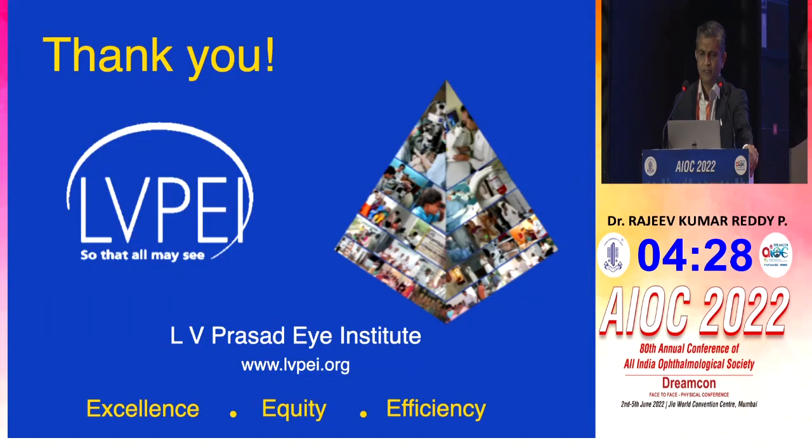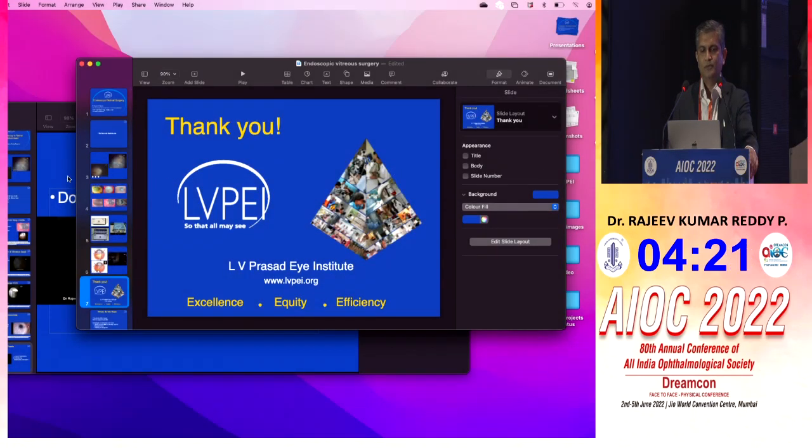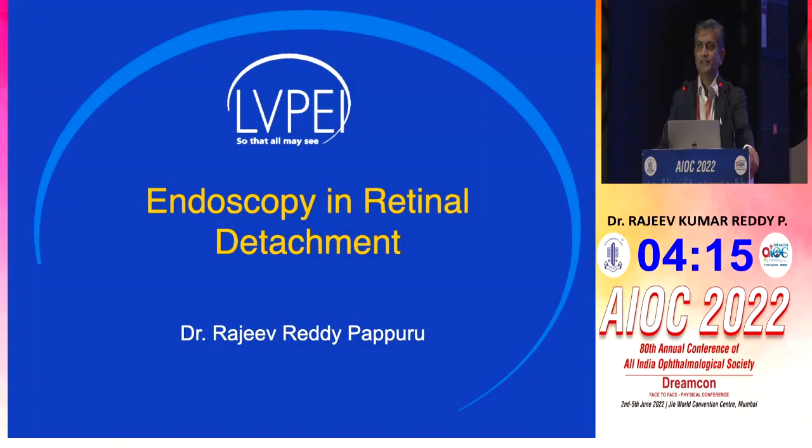So this is how it is about the instrumentation. So we will go to the next topic of how it is helpful in doing retinal detachment surgeries.